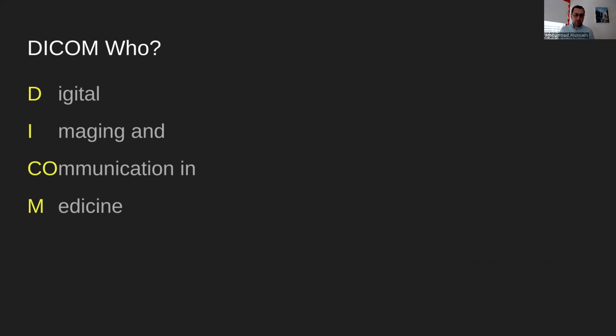Well, the DICOM standard is the de facto standard used in a lot of specialties, especially in medical imaging and especially radiology within medical imaging. It is a massive standard, I believe something about 7,000 pages or more. So in my line of business, it's always funny when the new guy hears about DICOM and says, yeah, I'm going to go read the standard. They're not going to read 7,000 pages. So usually people will read parts of the standard that pertain to the work they do, because DICOM covers a lot of ground.